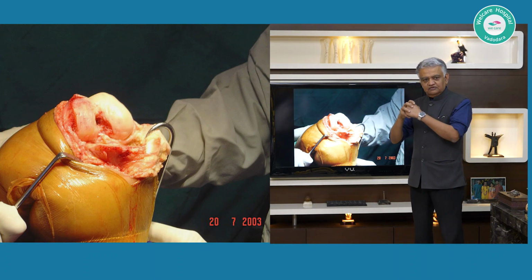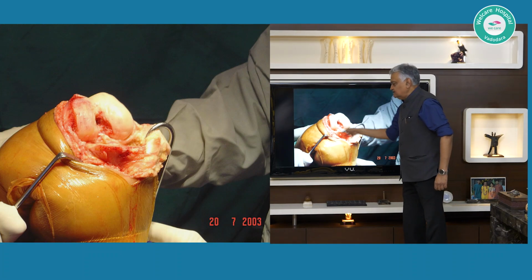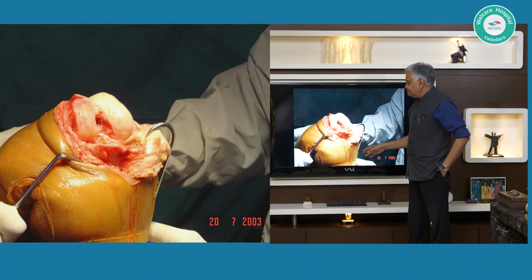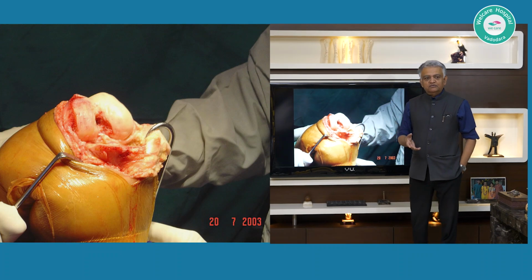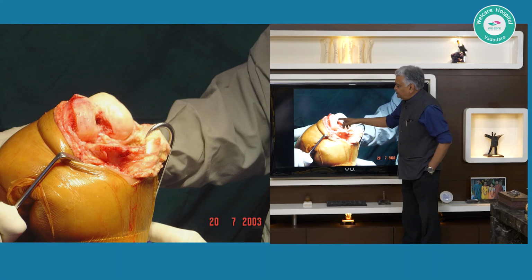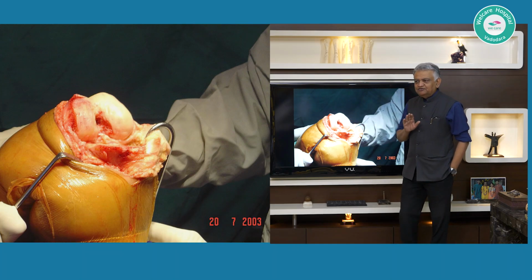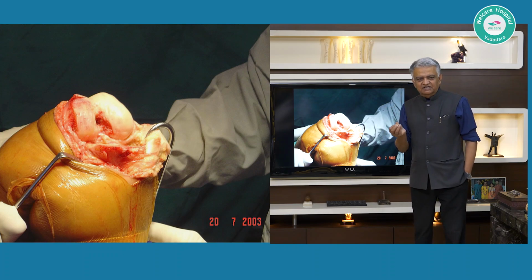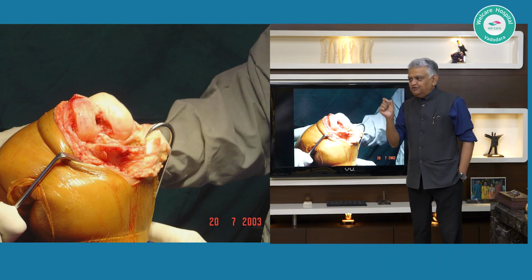So if you have been seeing only yellow bone marrow fat coming into your suction tube, do not kid yourself that you have evacuated the shaft. It is only when you start seeing red that the shaft would have been reached. And many times the trabeculae here are so strong that your catheter will not progress further, and in frustration you might just give up. Do not do that.